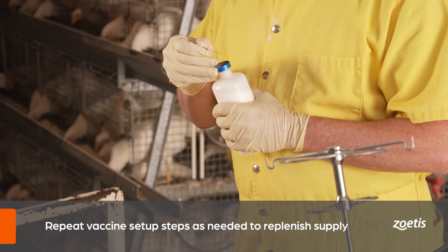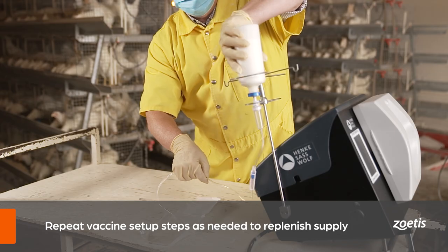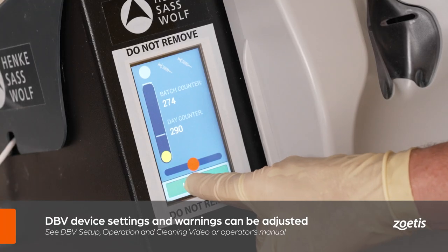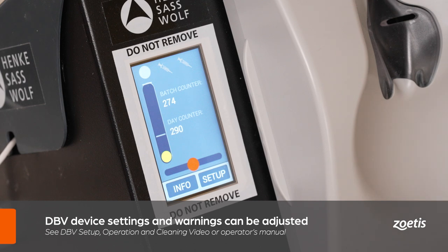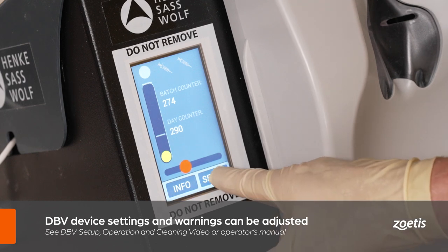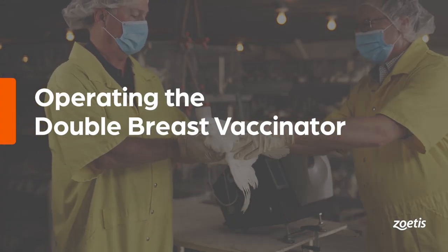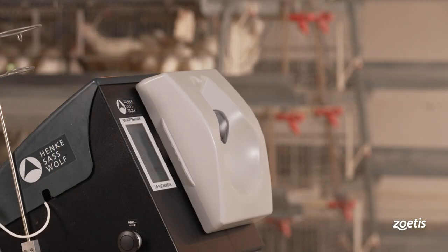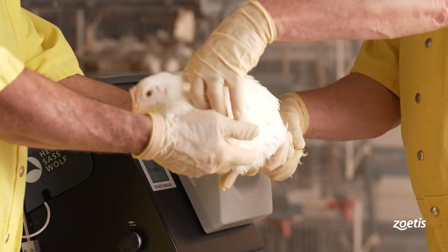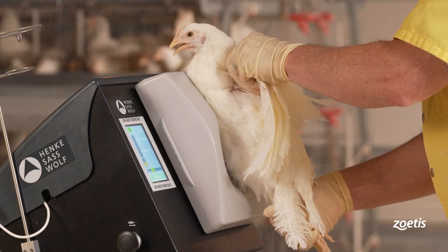After priming the line and checking the volume, reattach the breastplate and backplate to the device. The screen will change from setup to on-screen navigation. When switching bottles, repeat the steps for vaccine setup. Note that warning and sound settings can be adjusted on the DBV by following the instructions in the double breast vaccinator setup, operation, and cleaning video.